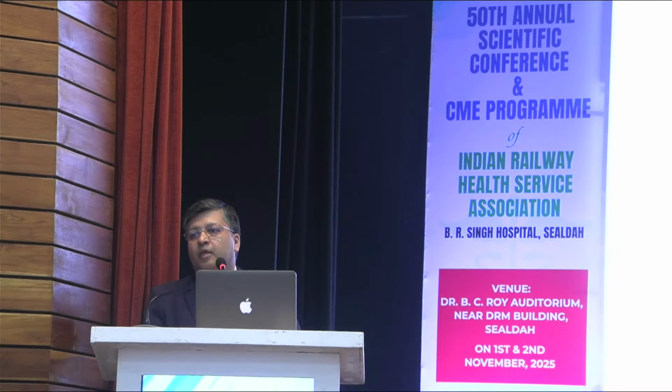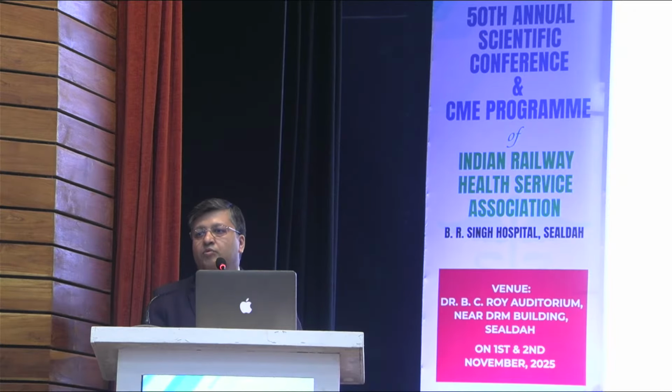For primary prevention of sudden cardiac death in a high-risk patient, you would identify the high-risk patient: low ejection fraction, prior MI with ejection fraction of less than 35%, dilated cardiomyopathy with end-stage heart failure, patients who are waiting for cardiac transplant. They are actually high-risk patients, and for those patients ICD therapy is beneficial. And some group of patients who have already suffered a sudden cardiac arrest, who were resuscitated by defibrillation, and when there is no reversible cause, like hyperkalemia, hypokalemia, or electrolyte imbalance, these patients are also candidates for ICD therapy.